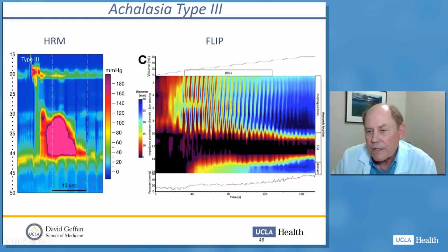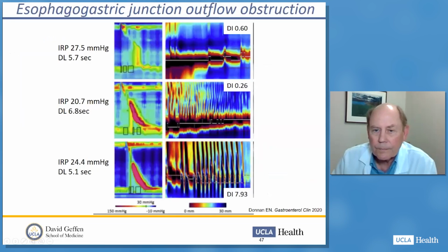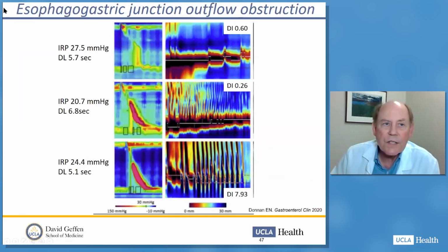The pressure is going to be high, and the distensibility index is again too low. And then finally, this is a place that the FLIP really helps us. It's in those cases where the integrated residual pressure is too high, above 15 millimeters of mercury.